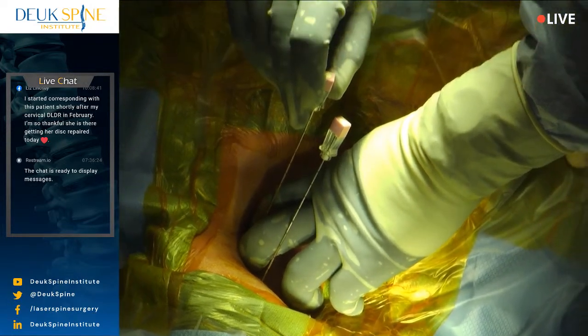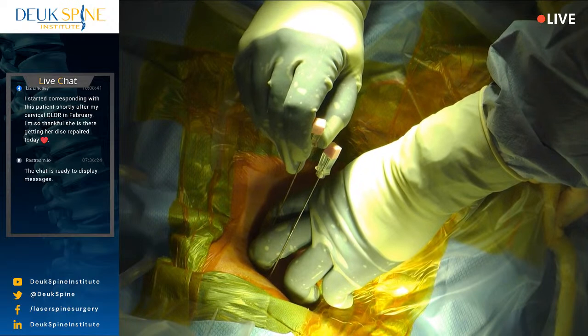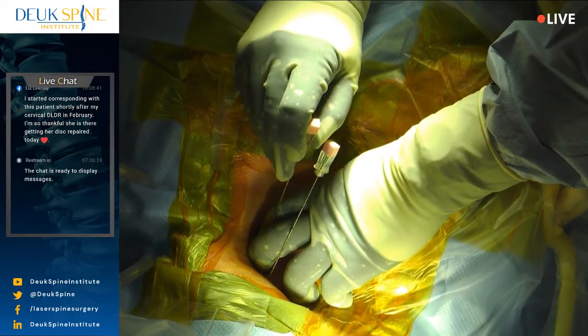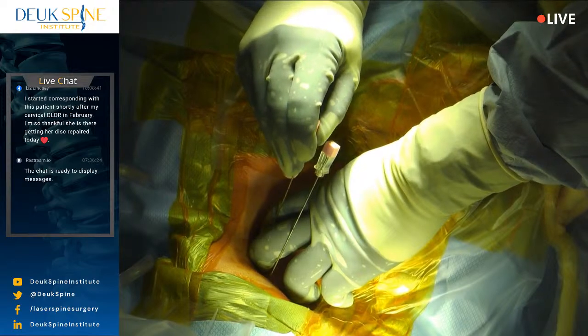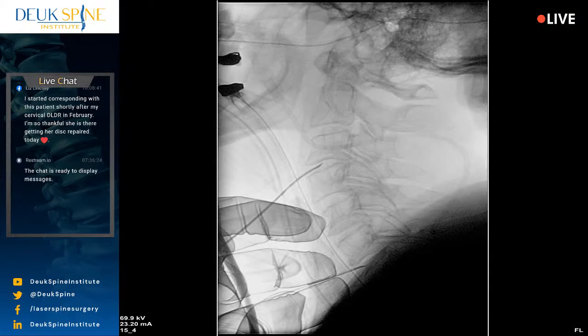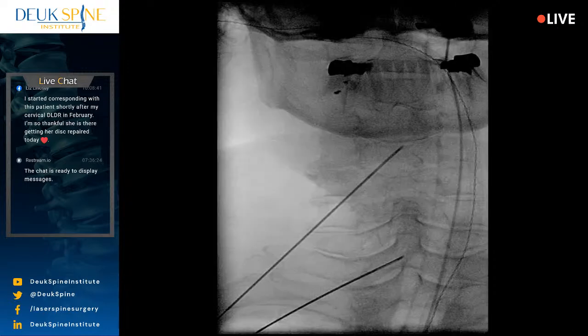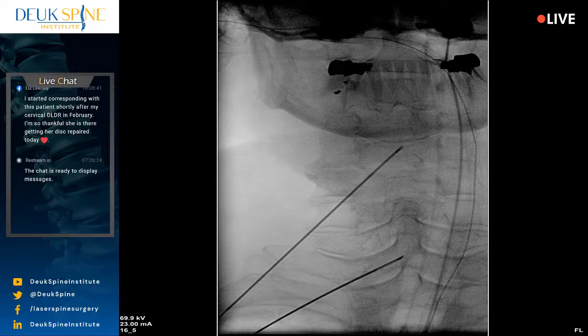Shot. Shot. Shot. Shot. Shot. Coker. Oh, good. Relax. I think we're there. That was tough. Whew. My fingers feel like they're going to fall off. All right. Give me an AP. That's good. All right. And the lateral. Let's just look one more time.